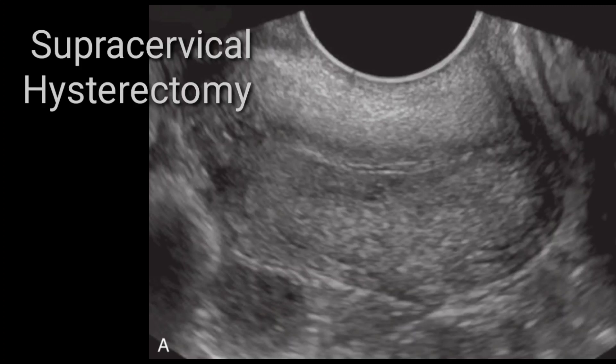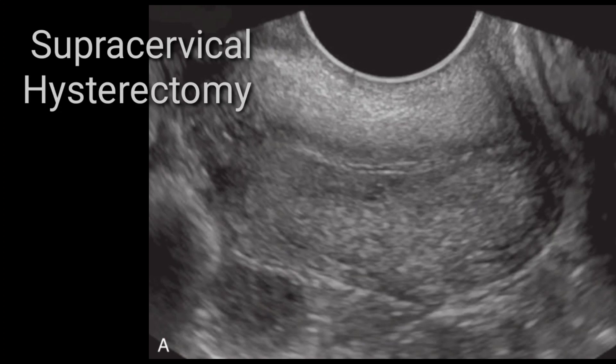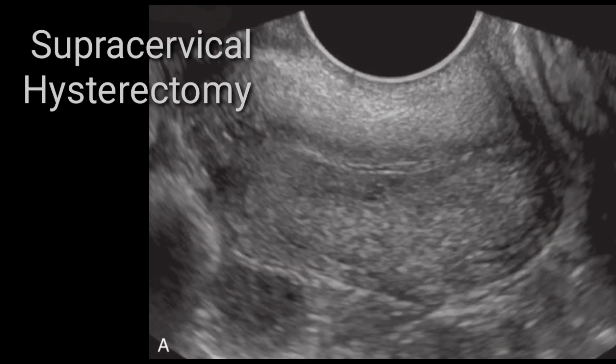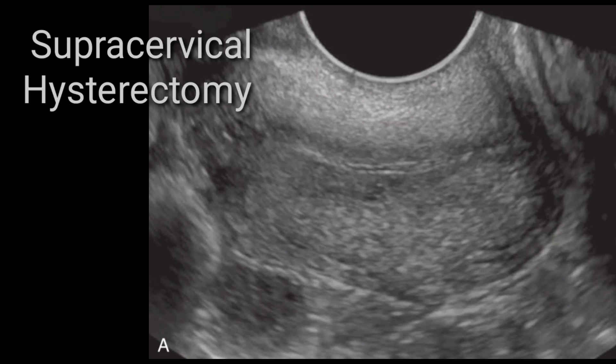On this transvaginal ultrasound image, you can appreciate a well-defined cervix. The supra-cervical area has been removed due to supra-cervical hysterectomy. In supra-cervical hysterectomy, part of the cervix will still be present — that can be considered either the full cervix or cervical remnants. Write on your report: cervical remnants measuring a certain size can be seen in the pelvic region on transvaginal scan.